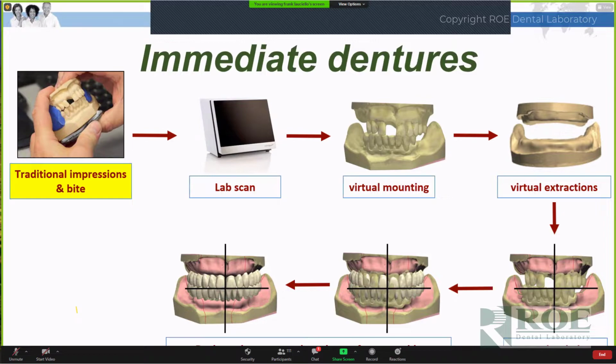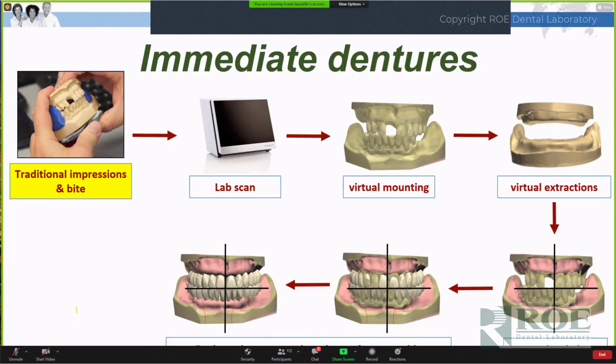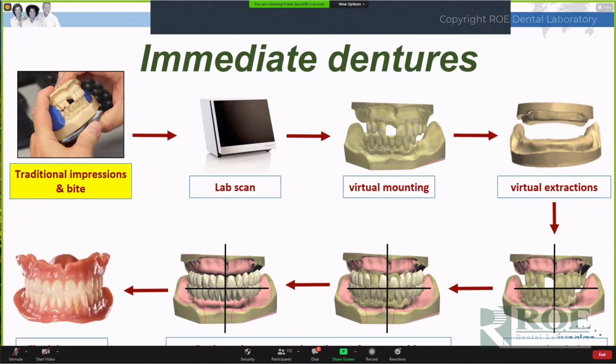Certainly, we're making corrections to them, but we have this information, and it allows the transition denture to be so much kinder to the patient and helps them transition, because there's definitely a better feeling of familiarity. And then again, combine this with the uniformity of thickness of the denture base, and gosh, you've done a nice service for your patient using this technology. So could we do it differently?